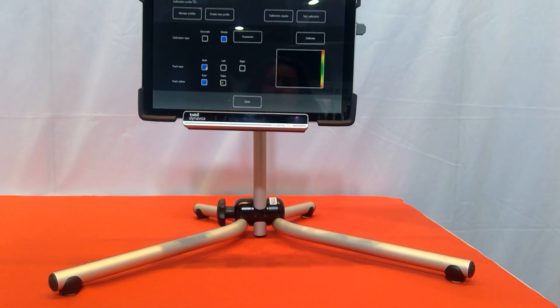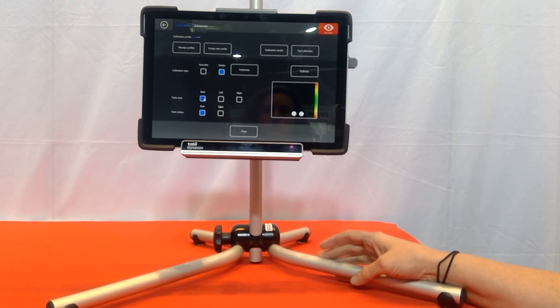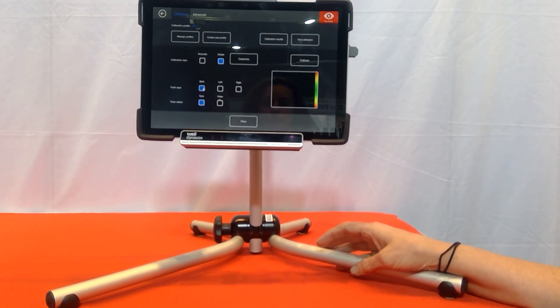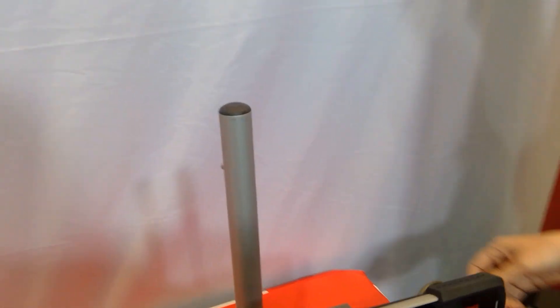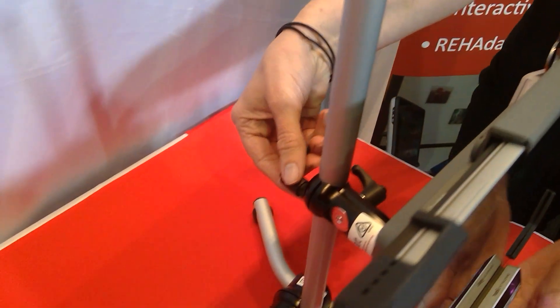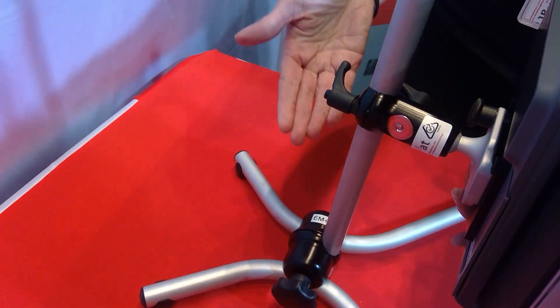So we can adjust the device and also the position of the user. Let's show you how we would adjust the position of the device. We'll come around to the back of the mount and we've got a lever here that we can adjust so that we can move the device up or down.